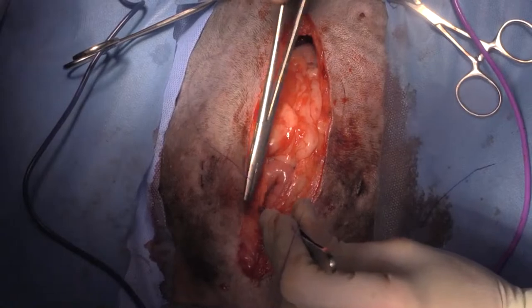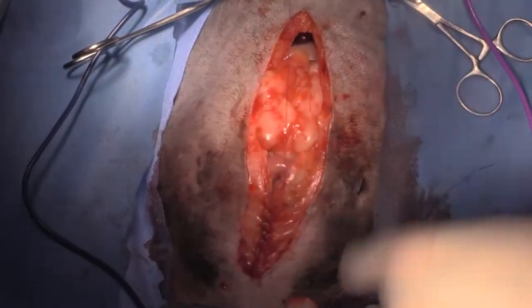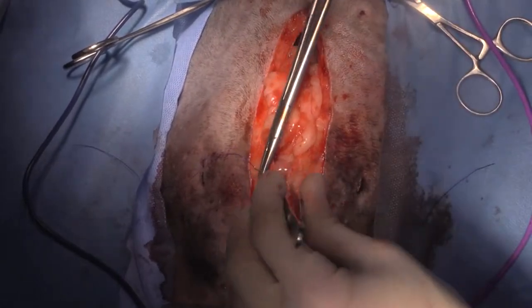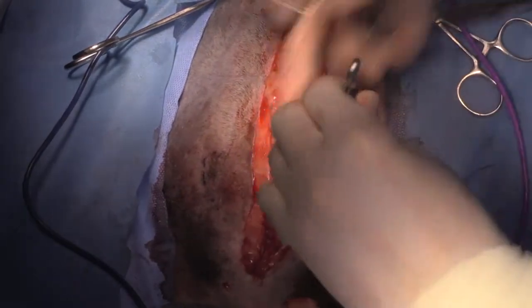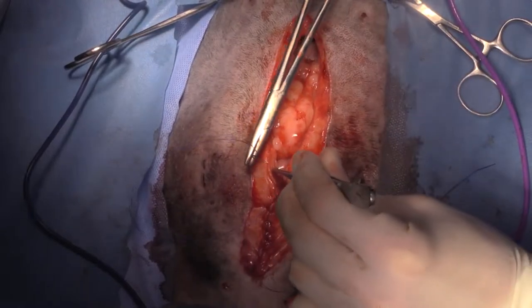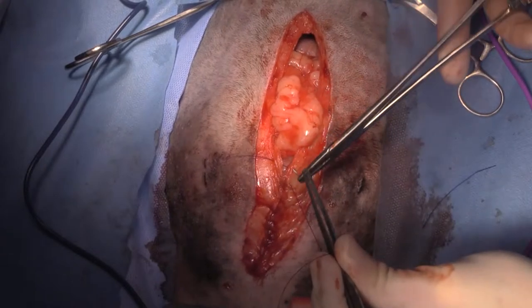And back again with another abdominal closure. So these pesky intestines have already sort of submitted a little bit. Once I got the first part of the linea alba back together, they've gone back in nicely, even though initially it looks like they were never going to fit in.